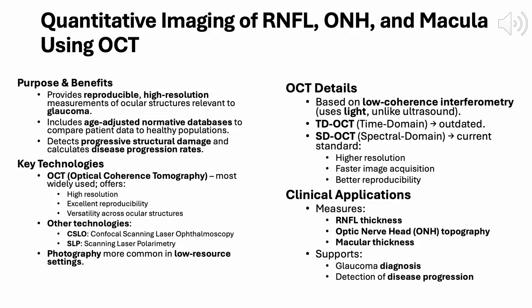The core principle behind OCT is low coherence interferometry. This uses light, not sound like ultrasound, to generate cross-sectional images. While time domain OCT is now outdated, spectral domain OCT is the current standard due to its faster acquisition, improved resolution, and superior reproducibility. There are other imaging technologies as well: confocal scanning laser ophthalmoscopy and scanning laser polarimetry.